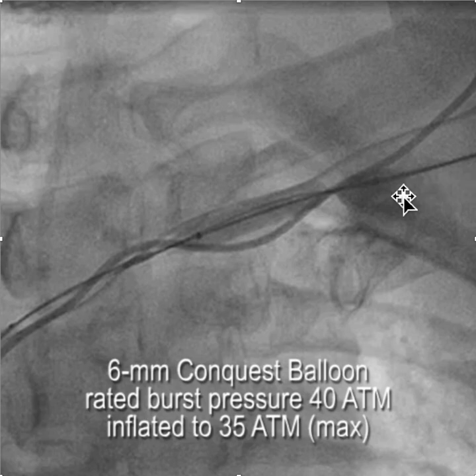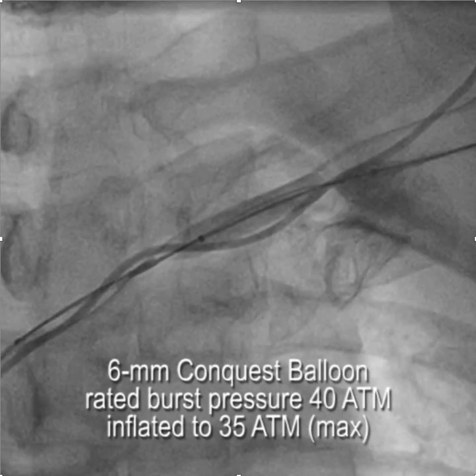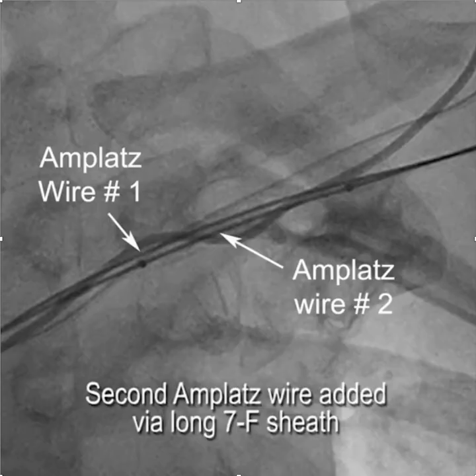Once we dealt with that, we took the catheter down over one of the V18 wires we had in place. This time we used a 6mm Conquest balloon. The Conquest balloon has a much thicker material and a larger central lumen, so it's more difficult to get through a tight occlusion. We got it through and inflated it to the maximum pressure allowed by the inflation device — 35 atmospheres — but despite that, we didn't make any progress.